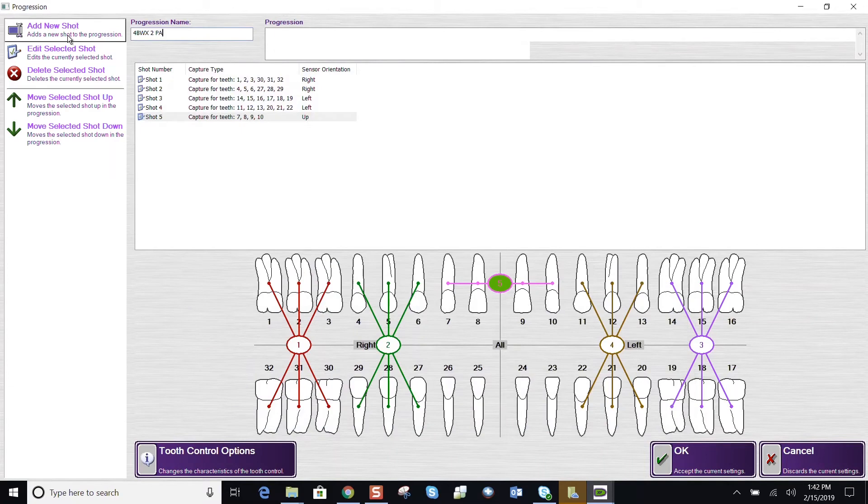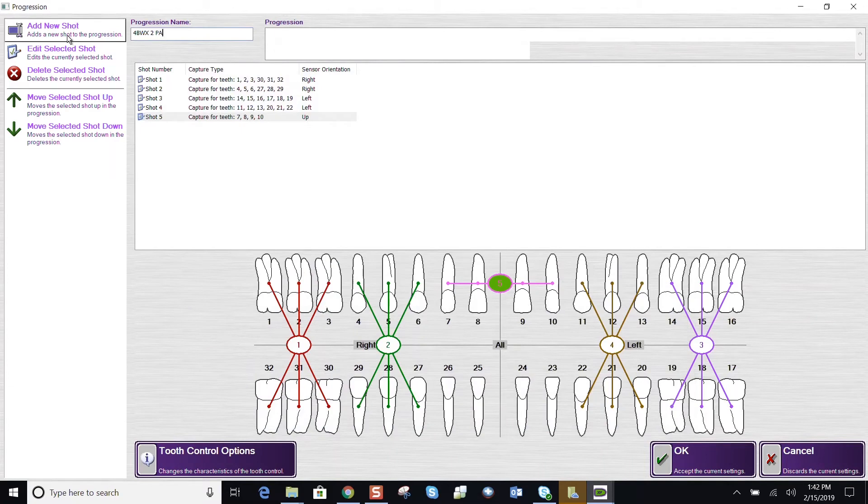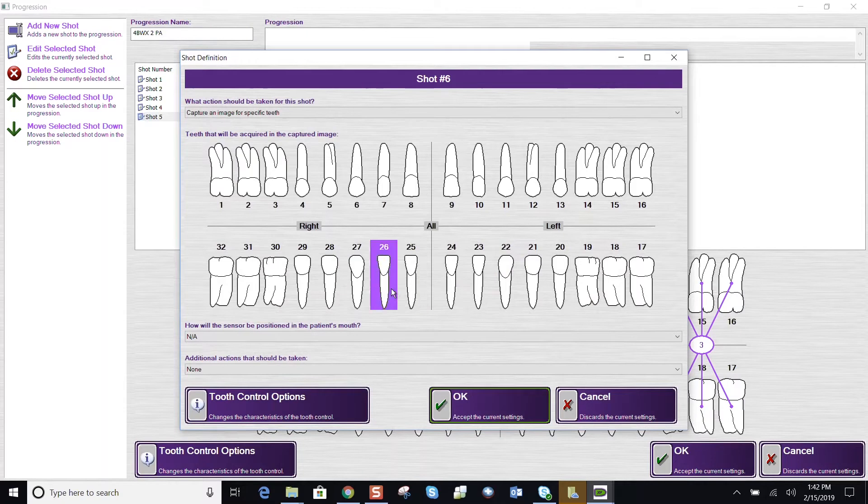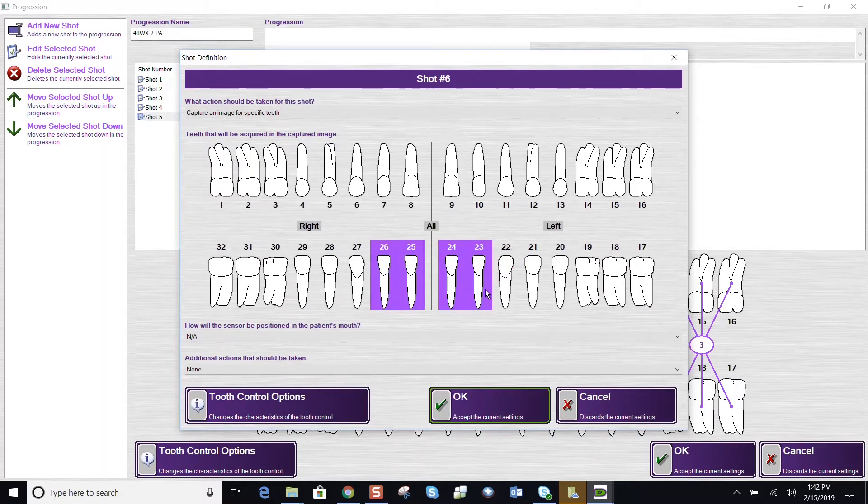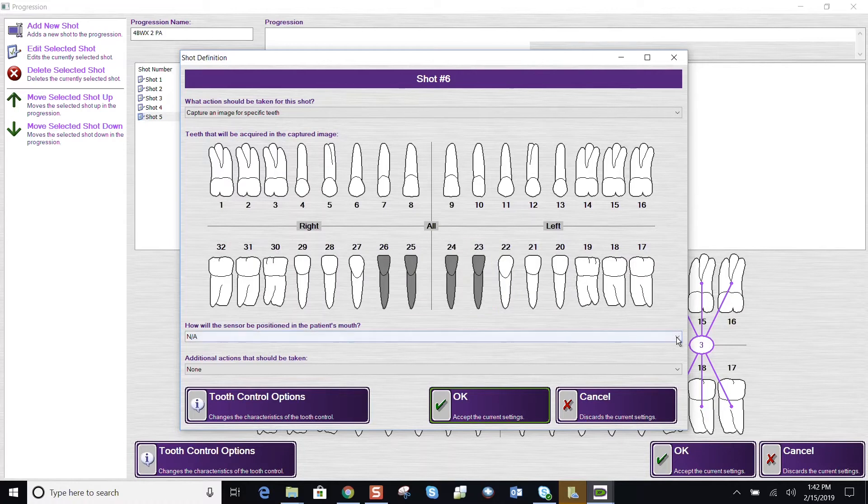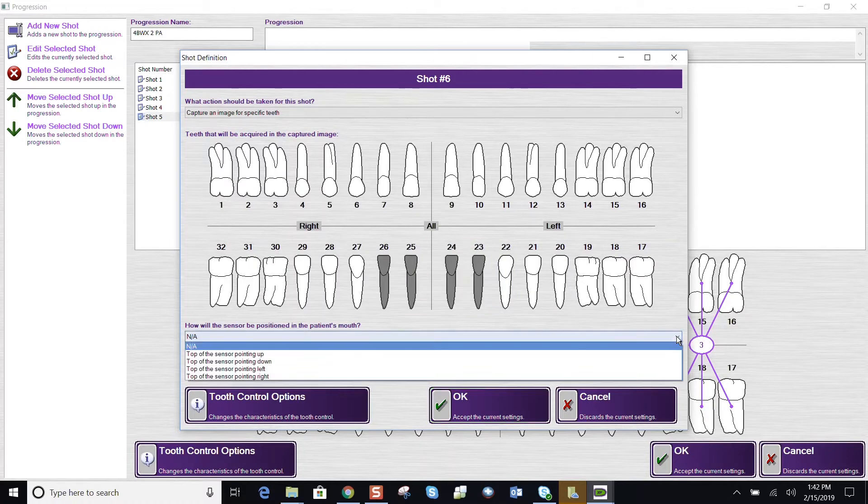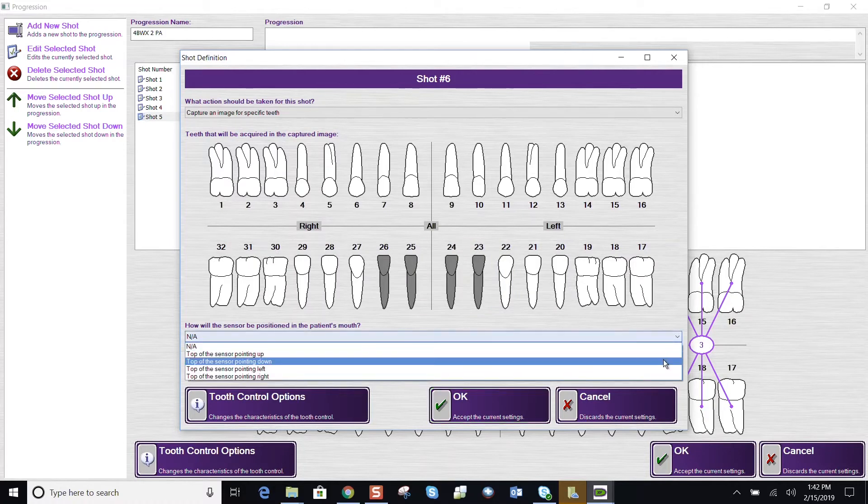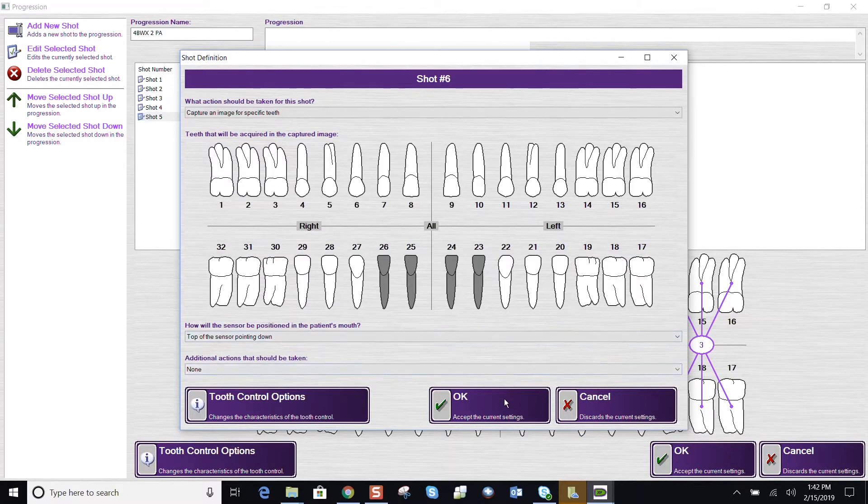That was my fifth shot. Let's add my sixth shot for lower anterior periapical. Highlighting the teeth associated with that image. Orient your sensor. The top of it now is pointing down. And we say OK.